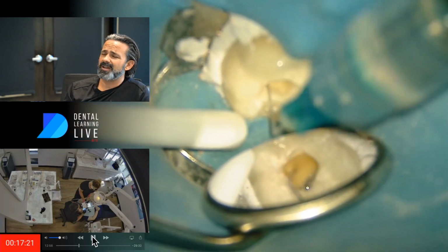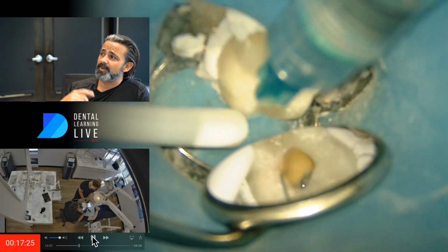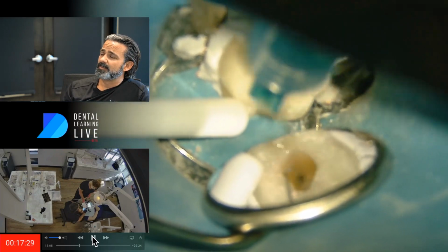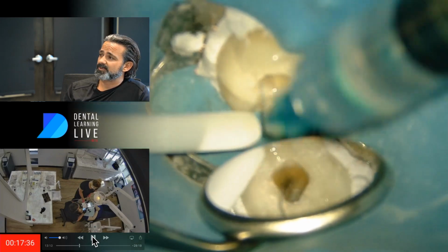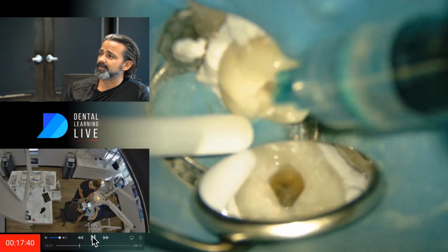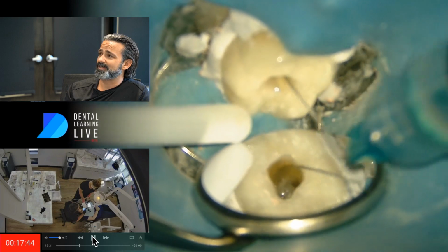Just keep it flowing. And I'll go back to alcohol at this stage too to help ball it up, and then if I need to go back to a rotary, I can. But I'm going to try to get this thing off. So I'm 17 minutes into the case, which is pretty common at this point through retreatment. Fortunately, I'm not removing posts. We all know what that goes like.